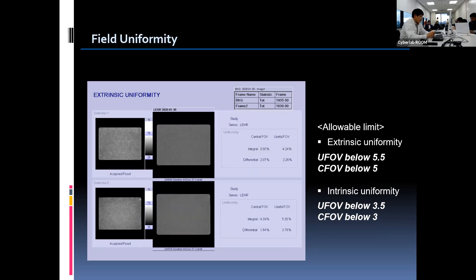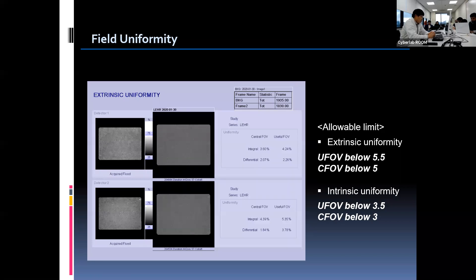There are allowable limits for non-uniformity established by the manufacturer. Non-uniformity in UFOV should be below 5.5% and 5% in CFOV. The intrinsic uniformity limits are lower than those of extrinsic — 3.5% for UFOV and 3% for CFOV. The limit can differ slightly depending on the camera vendor. We also carefully review the flood image to check for any non-uniformity or artifact. When we look at the acquired image and values in the report, we notice that the flood uniformity is satisfactory within the limit. We complete the field uniformity test daily.